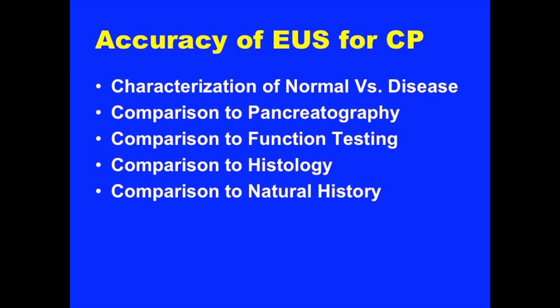So did that really help us in doing this? We've tried to look at that agreement at our own institution and others, comparing Rosemont to conventional criteria, and the answer for most places is it really didn't help us that much. So we still have a problem with our sensitivity being very high and the potential for overcall being high.